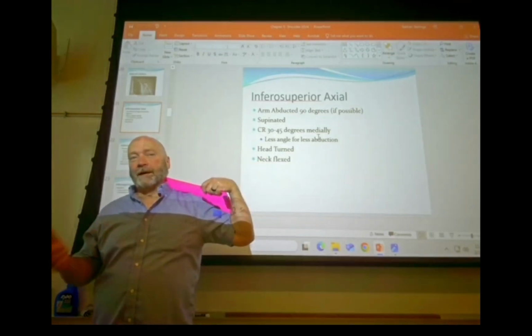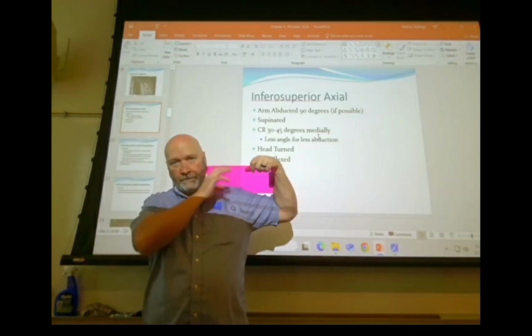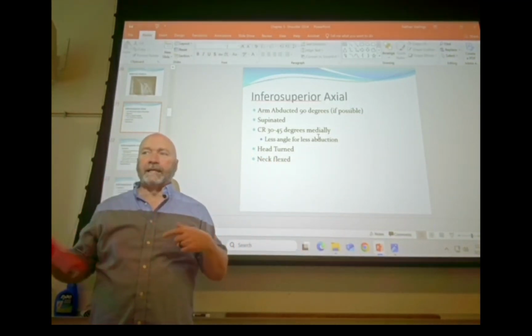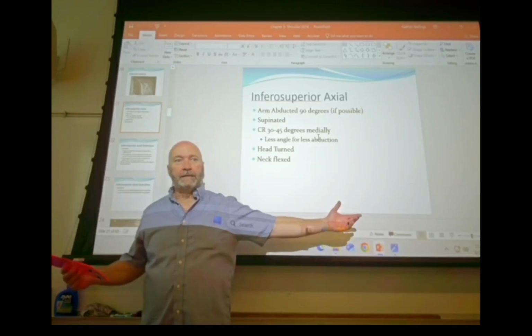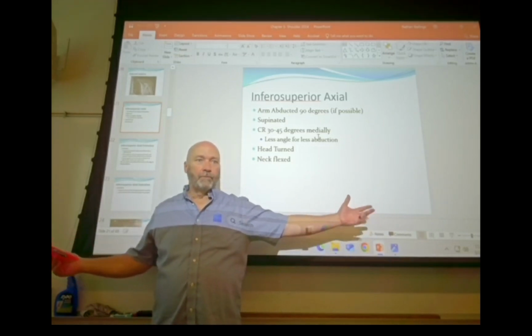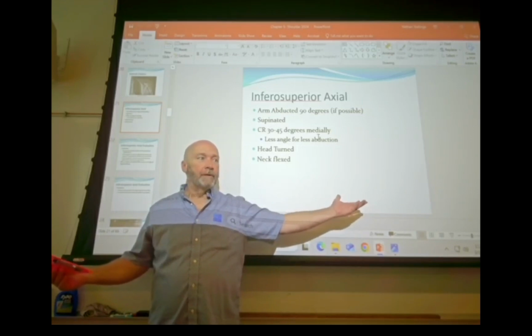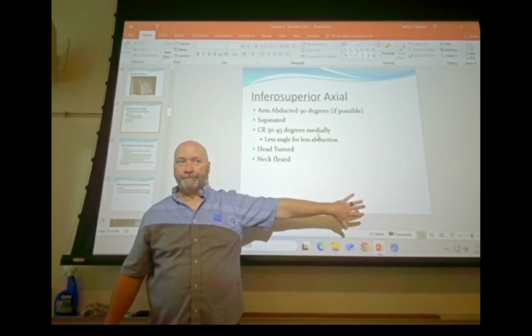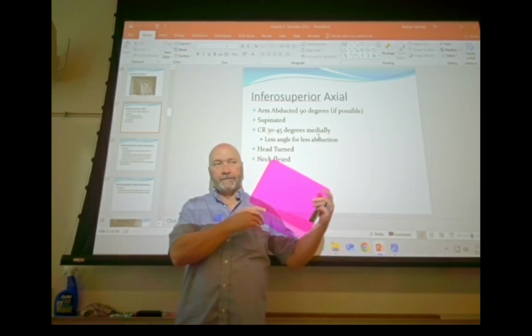So a very important step that we have a tendency to overlook. If the patient's laying flat on their back, then you can put the patient to work. Some of your positioning textbooks, they're real meticulous in how you're supposed to position this. All right, so I'm laying flat on my back. I get my arm extended in a natural lay. If I'm laying on my back, what's the position of my hand? Supinated, right? Well, they'll point that out, but it's pretty common sense. I mean, if the patient has some sort of shoulder issue, is that happening? No, it's not, right? So just understand that's what they're talking about.